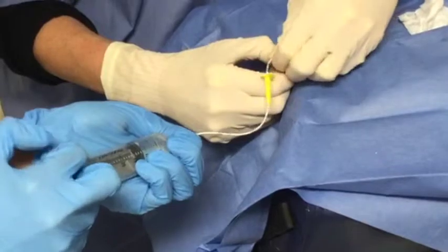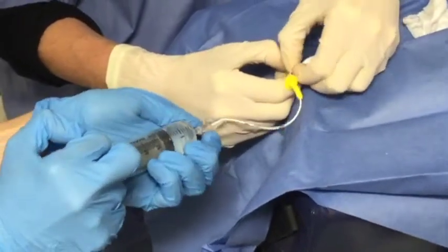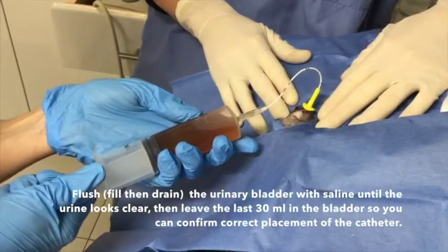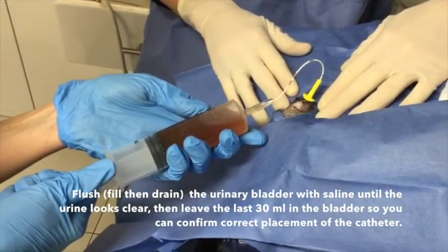Once the catheter passes into the urinary bladder, drain the urine from the bladder and save the samples for urinalysis and culture. You can further flush the urinary bladder and urethra using sterile saline.